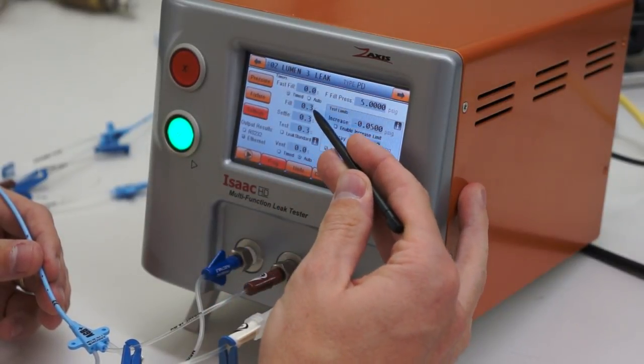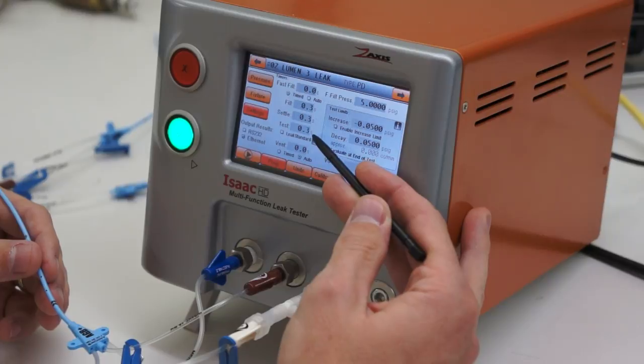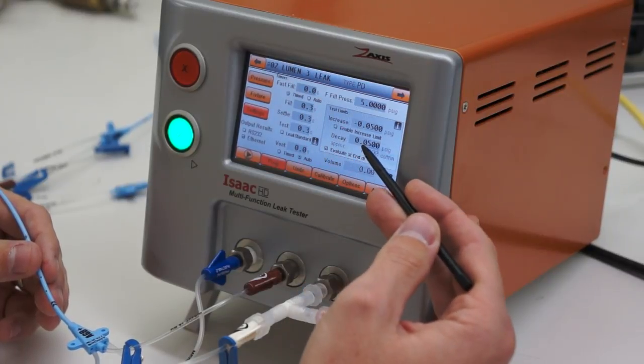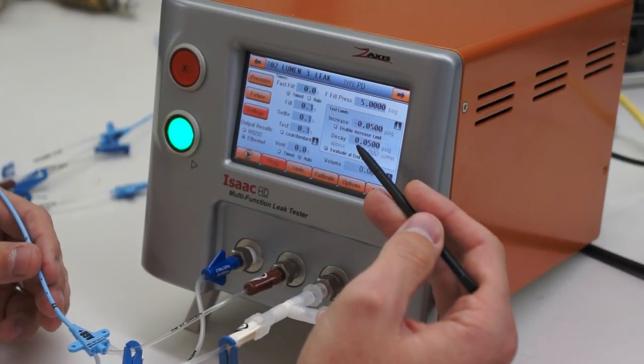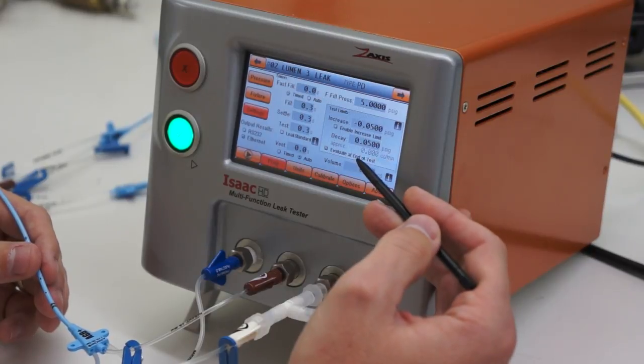We are filling for 0.3, settling for 0.3, testing for 0.3, and we're looking for a maximum decay of 0.05. That's just a number we've set. It will change later on.